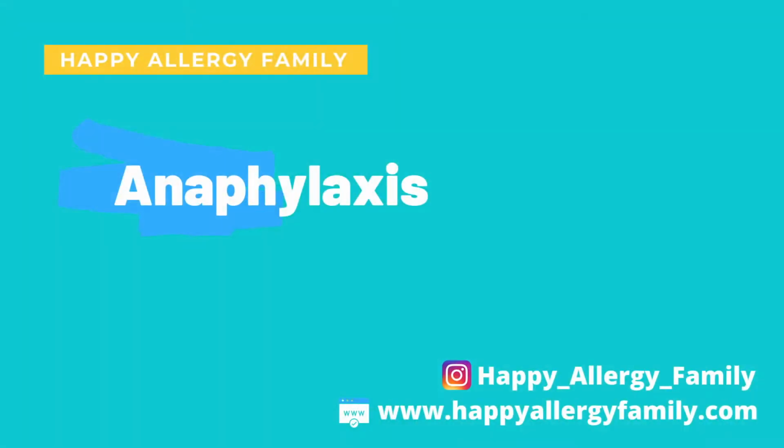So first and foremost, what is an epinephrine auto-injector? An epinephrine auto-injector puts epinephrine into your bloodstream. While there are many uses for it, the one we're going to focus on is for food allergies. Now, contrary to what some people think, food allergies are not just a minor nuisance. They can be extremely severe. And reactions that you can have, and particularly reactions called anaphylactic reactions, can either cripple you or possibly kill you. So these are extremely serious conditions.